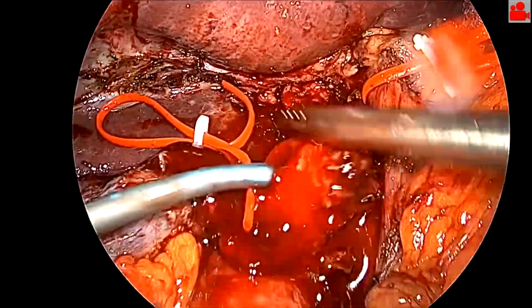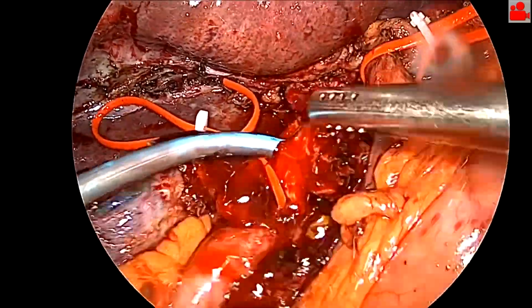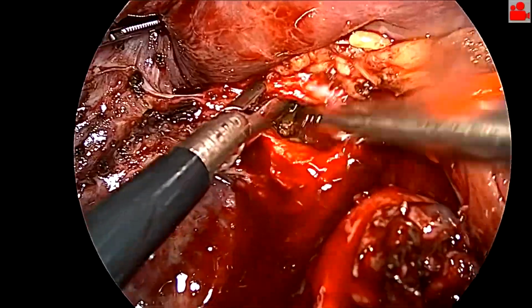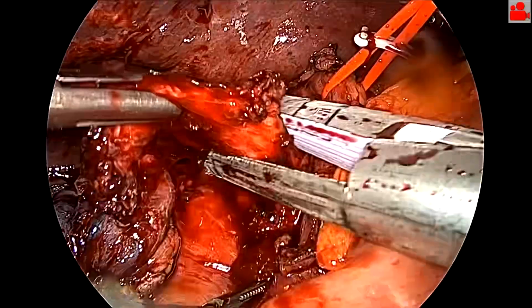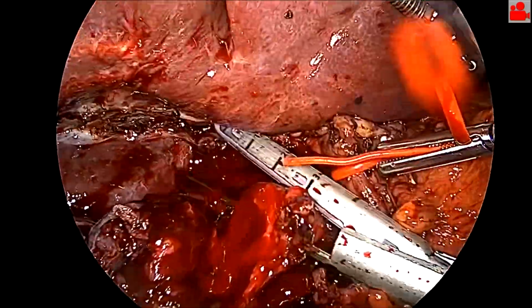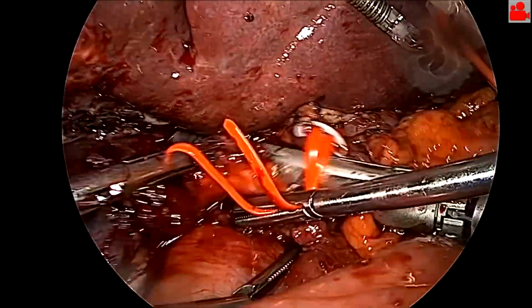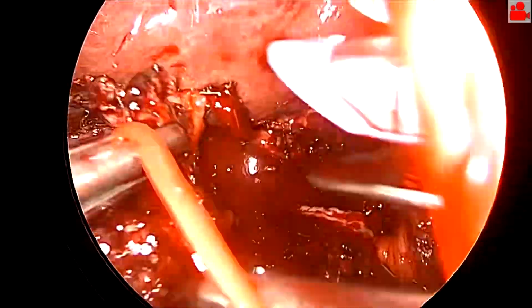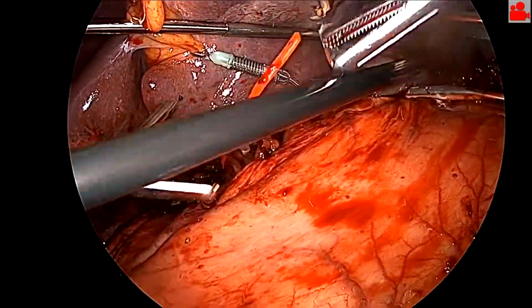At this point, you can already see the trapped stones within the CBD. We extract the plastic stent from the distal bile duct that was inserted previously during ERCP. Then we proceed to perform an excision of the specimen with closing the stump of the distal bile duct using a stapler.